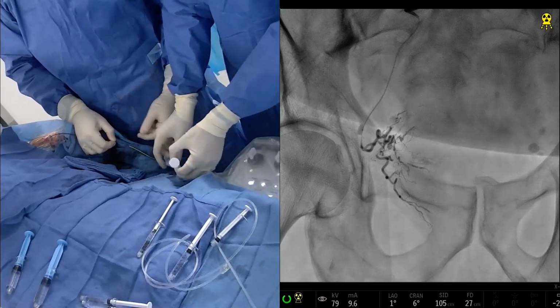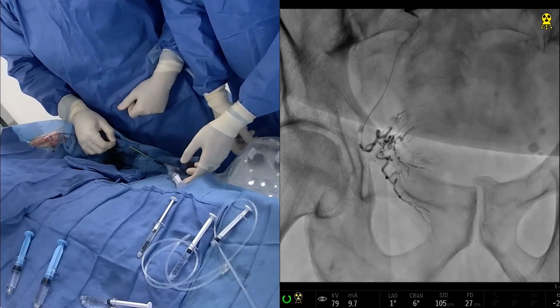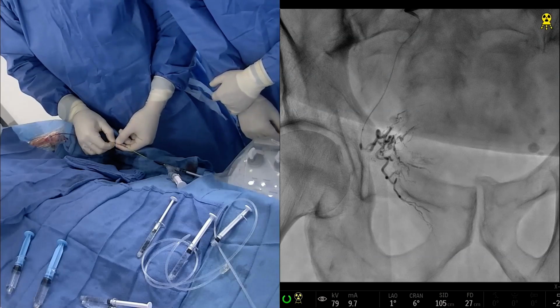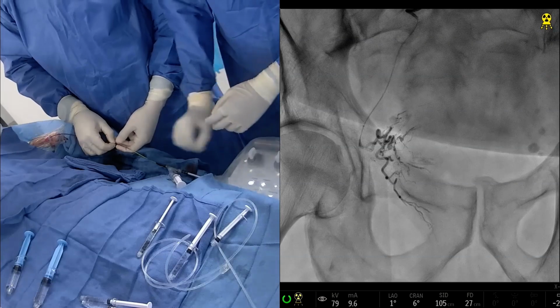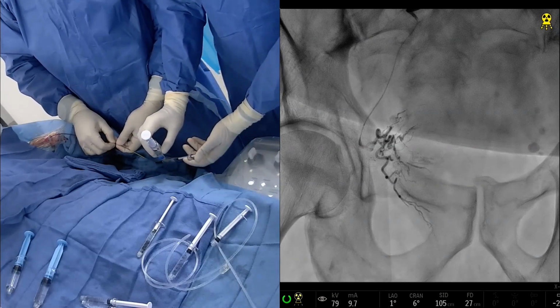And so as we sort of wait here, we're going to wait for that to solidify. Then we're going to deflate the balloon, which is what we're doing here. And you can see now you see antegrade flow again. To decompress, solidify, you also decrease the pressure head. Yeah, exactly. We can put a little bit more here on the way out just to create a little bit of a proximal plug. Just drop a little bit here, right there.